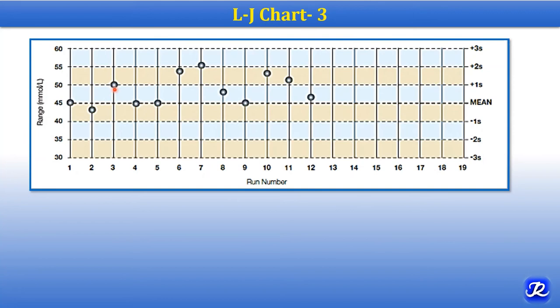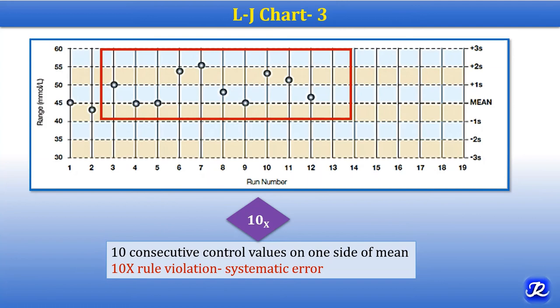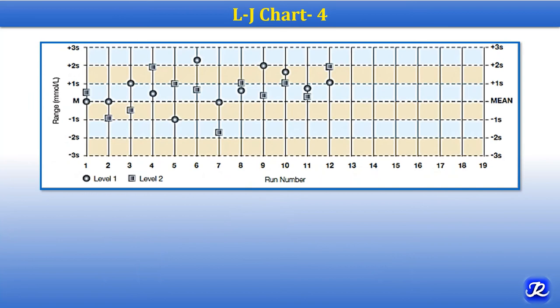In this LJ chart, from the third run, all measurements are on one side of the mean. If you count, there are 10 values. This denotes the 10X rule, because 10 consecutive control values are on one side of the mean. This is a 10X rule violation, which shows systematic error.